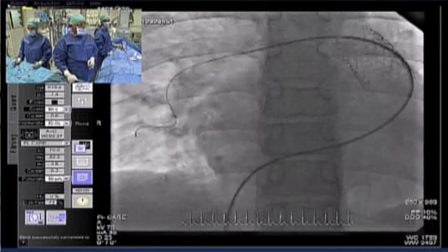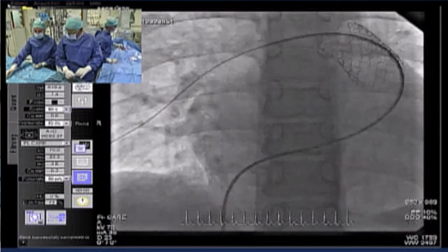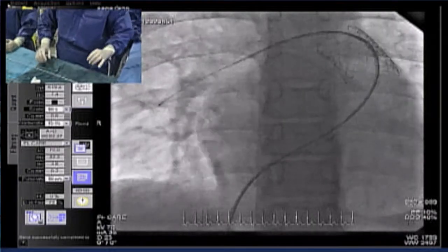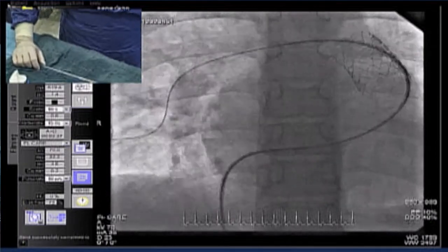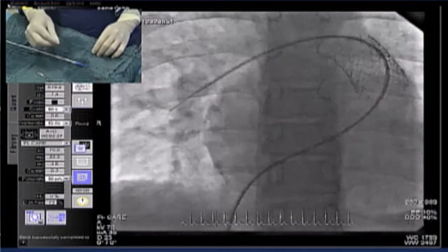Okay. Jay? I think in this patient, I noticed that the right lower part of the proximal part of the stent was a little bit protruded from the RVOT. So in this patient, I think the right RPA may be better. Okay, Mark, please continue. We have about 10 minutes with you for this case.